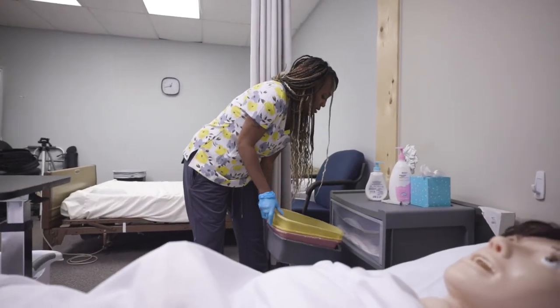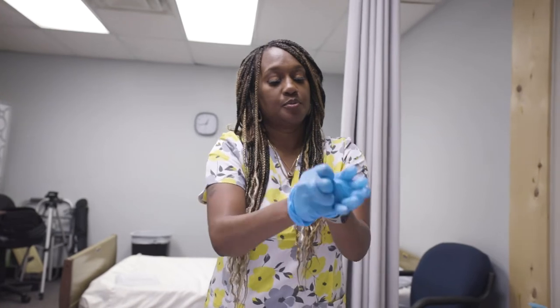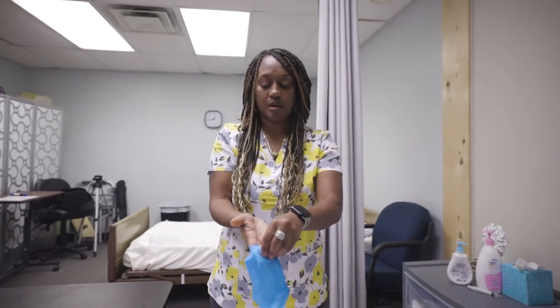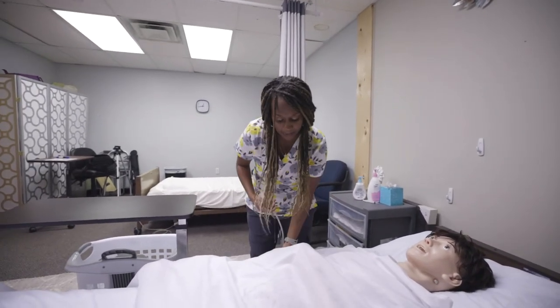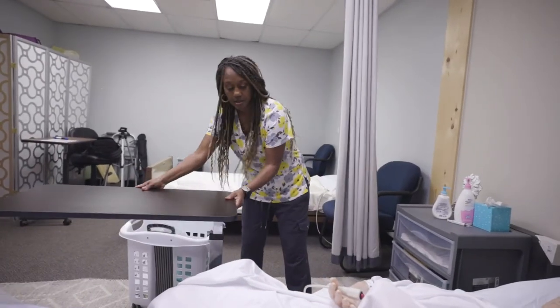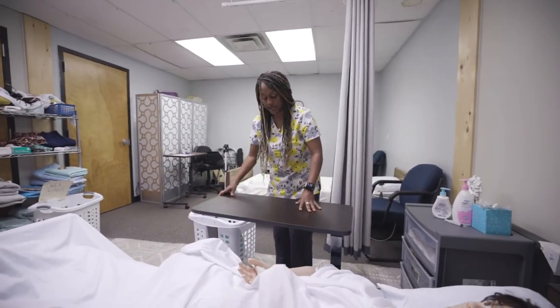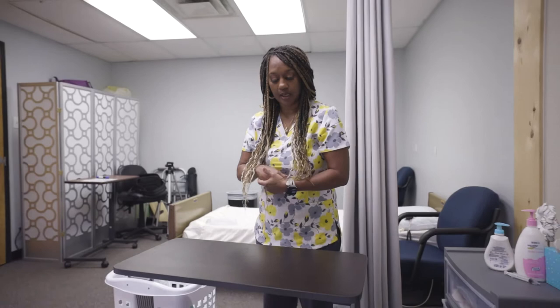This is for Prometric testing in Texas. Now take off your gloves — pull and peel off the fingertips — then wash your hands. Mrs. Smith, here is your call light; your bed is still locked in a low position. Would you like your curtain open or closed? Would you like your bedside table next to you? If you need anything, just push the button and give me a call. I'm reviewing my checklist card now while washing my hands again — and it looks like my skill is complete.